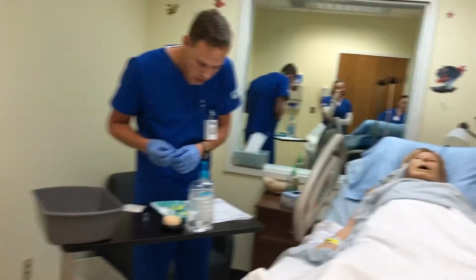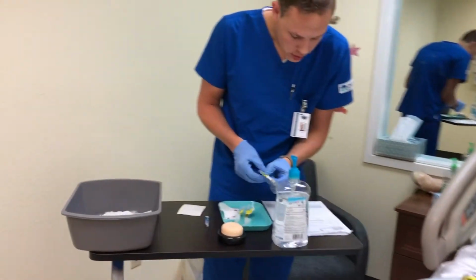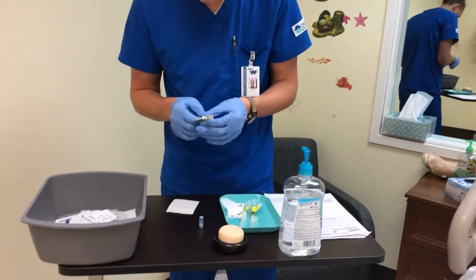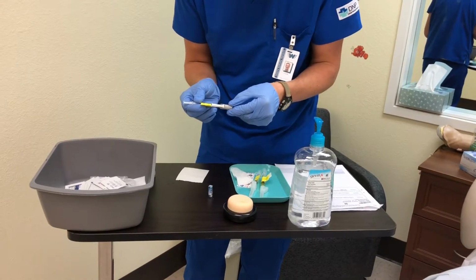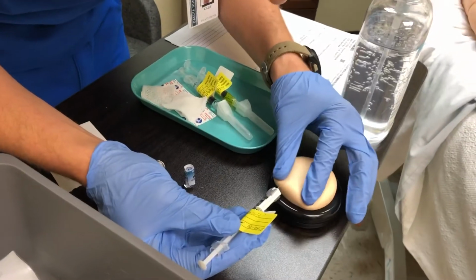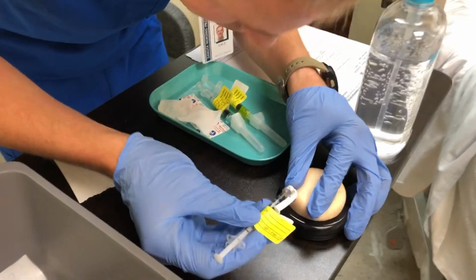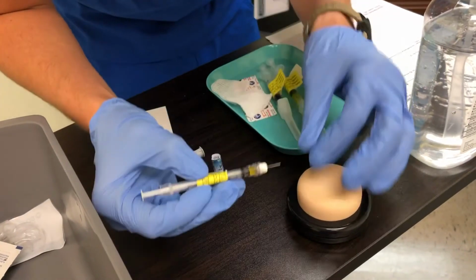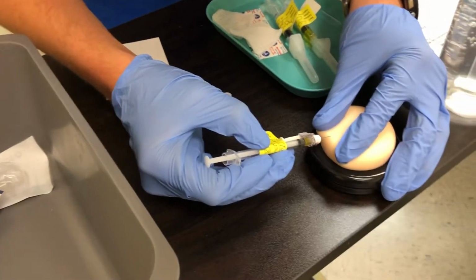And so that first one's going to be that tuberculin test. So I'm going to make sure I still got it here. So it's the PPD tuberculin. Okay, PPD tuberculin. And so that one's just going to be done underneath the first layer of skin. So we're just going to uncap that. And I just want to make sure I can get a new spot that doesn't have any poked holes in it, so I don't have any leakage or any sort. And then I want to make sure that the tip is on top. And stretch the skin. And then we're going to feel a little poke, okay, Shirley?